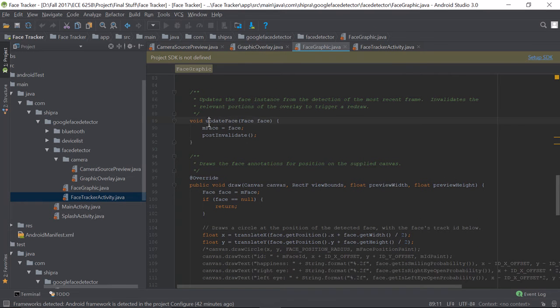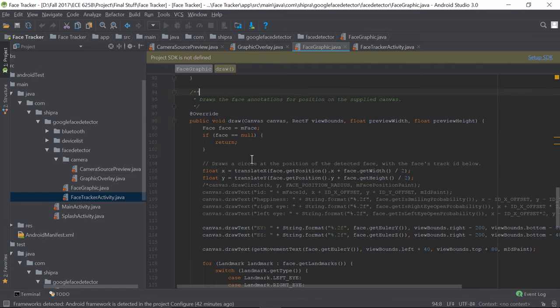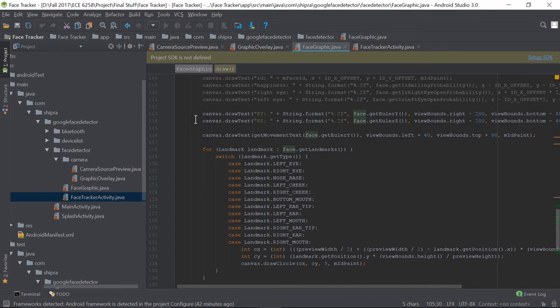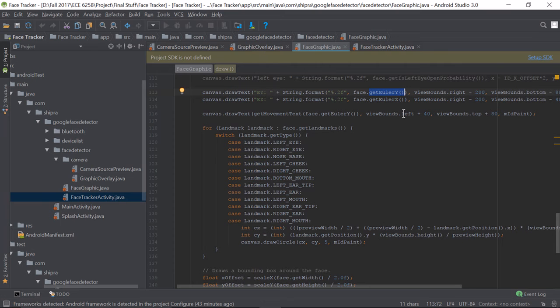Update face is basically the function that uses the algorithms that we have used in MATLAB and similar to them in our Android, and the object is called face. Up here is where we are getting the detected face, and you can get the x and y coordinates and get the position. So using the face object we are able to do that. And then this is how we are able to print the final Euler angles out provided by Google. So we started using that. It helps us in being much more precise with respect to our positioning.